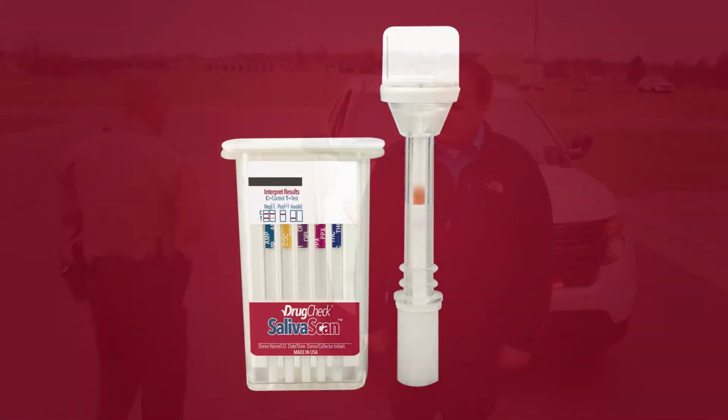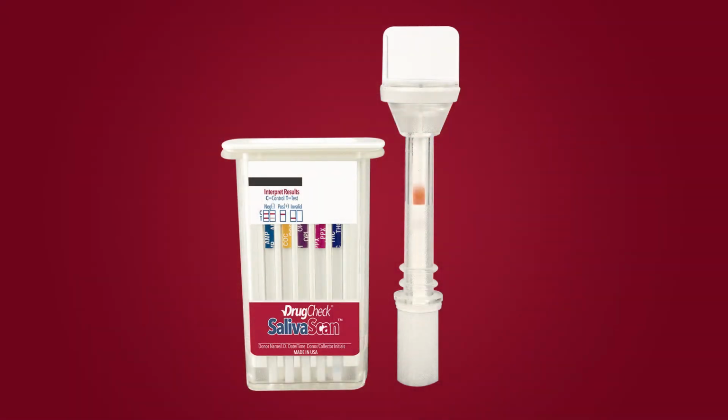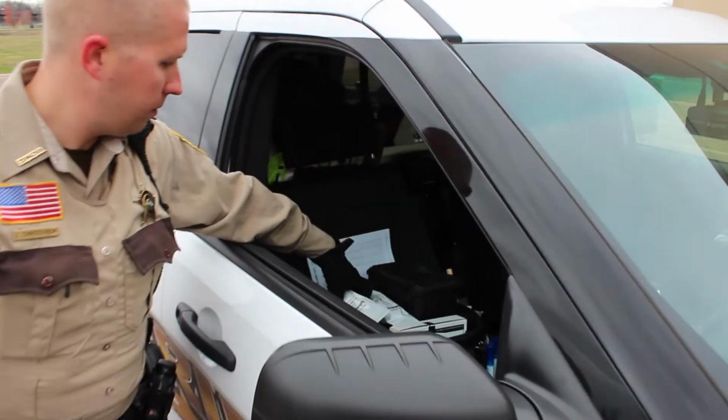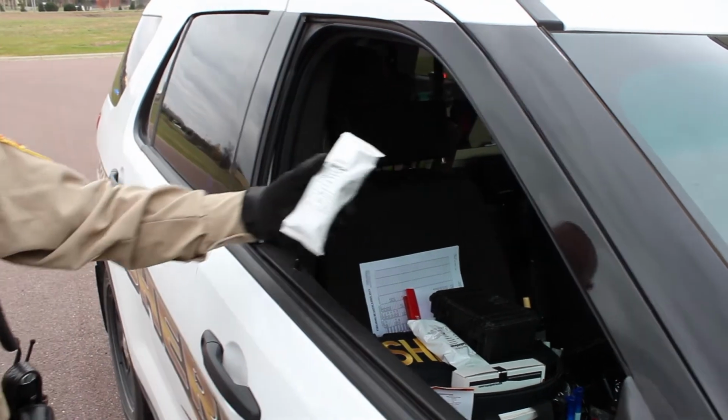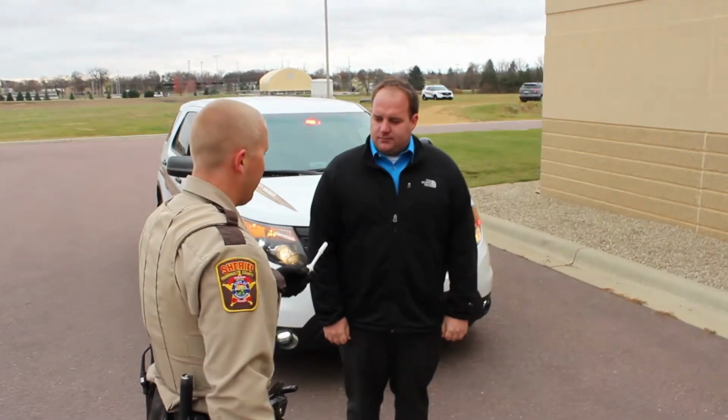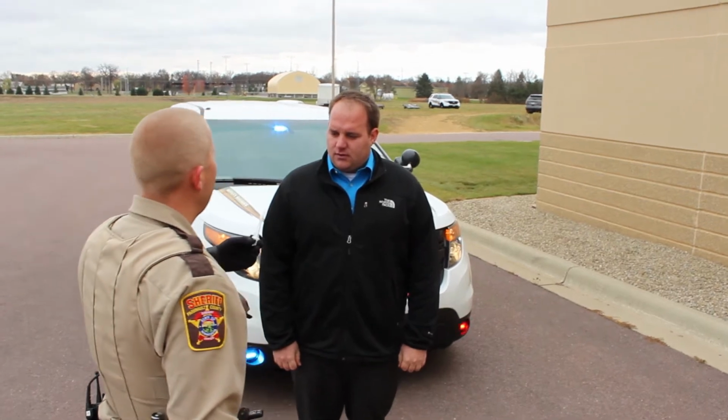The DrugCheck SalivaScan is a forensic use-only, oral fluid presumptive screening tool that can be used by law enforcement officers to test for up to 10 different drugs in a matter of minutes. Officers will need to follow these simple steps.